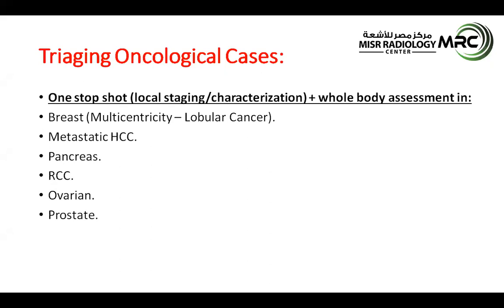We have also the prostate tumors, the cancer prostate. Of course, MRI is of utmost importance in the local staging, so combining it with the distant metastatic assessment is of utmost importance to verify the load of tumoral involvement in different patients.